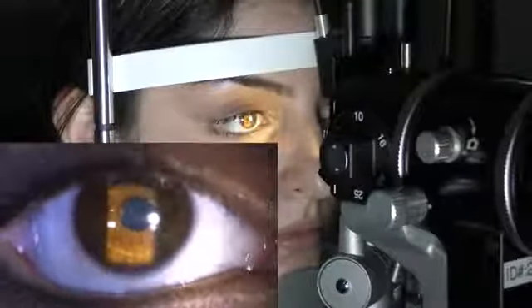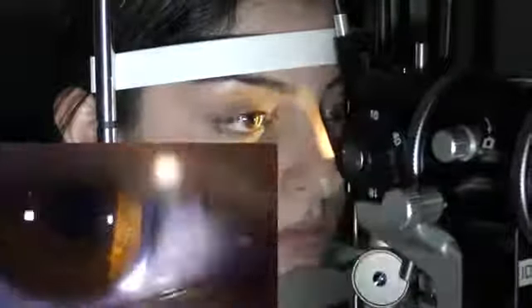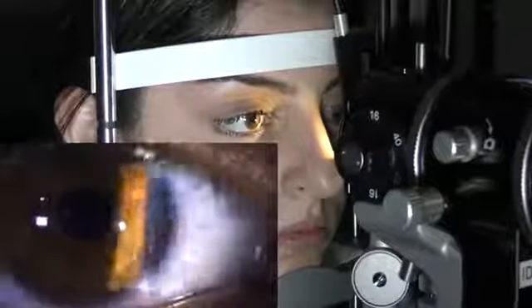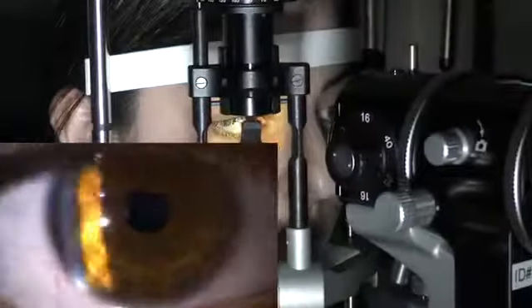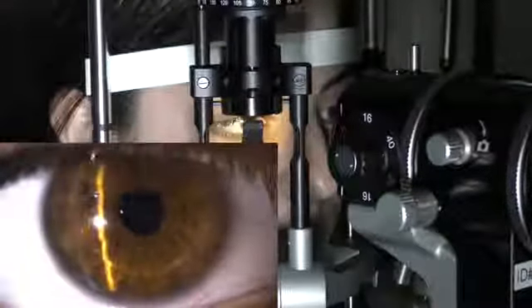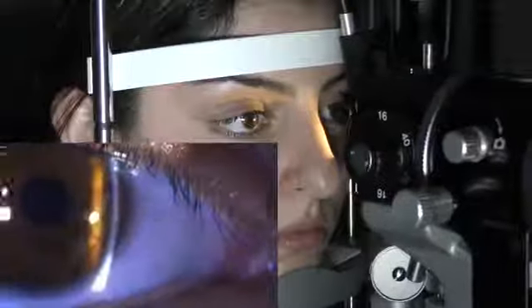Okay, starting with the limbus. Look straight ahead at my ear, please. Good. So just focus on the limbus here. You can increase the magnification as you move on to this step, just because you want to look at the structures in more detail. Swing the light over, okay, and look at the cornea. I like to make a nice thin section when I look at the cornea, okay? Very important. This is called the optical section or parallelepiped.